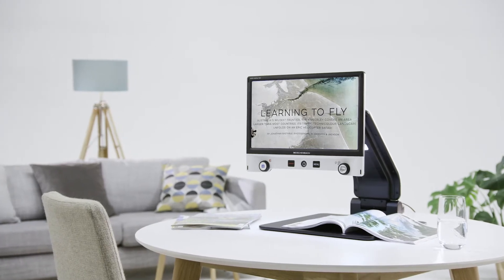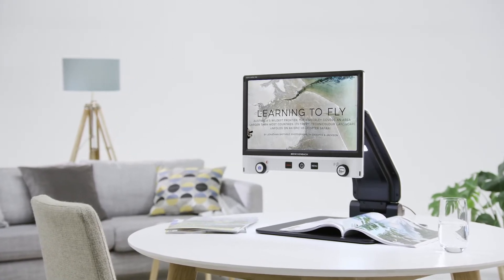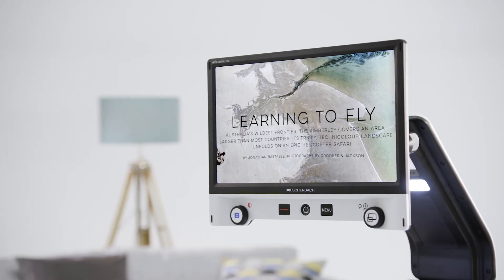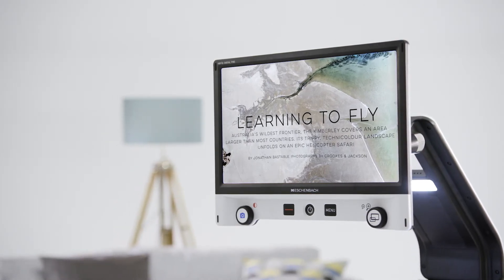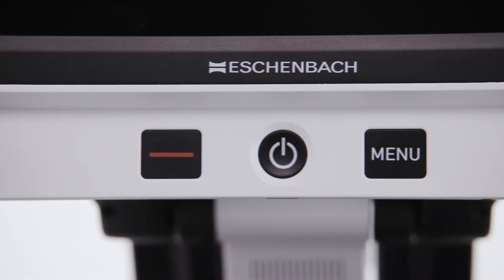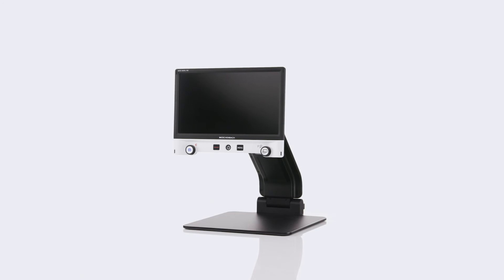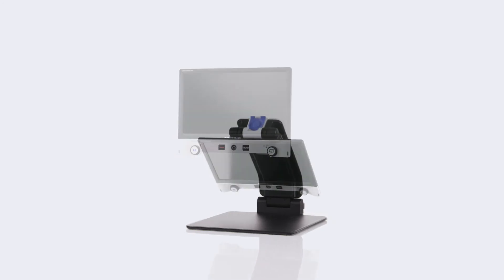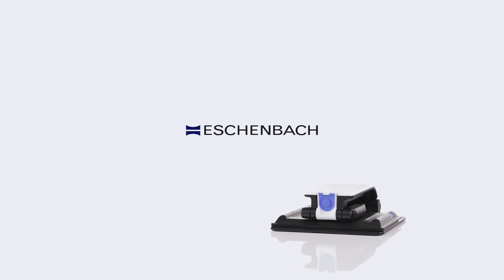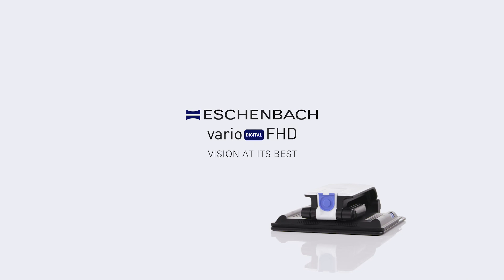The Vario Digital FHD combines flexible design with a user-friendly interface. Thanks to a high range of magnification, outstanding image quality and intuitive operation, it provides the ideal video magnifier solution for reading and leisure viewing while at home, work or school. Vario Digital FHD — Vision at its best.